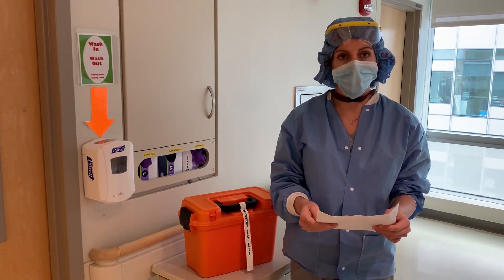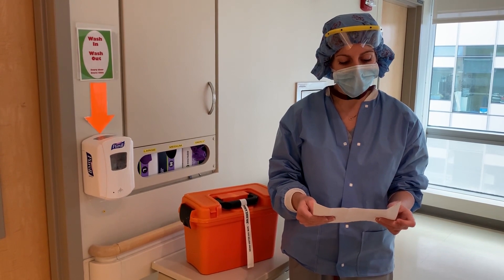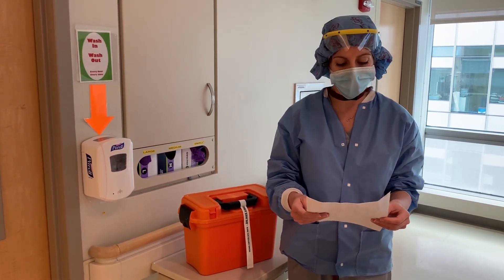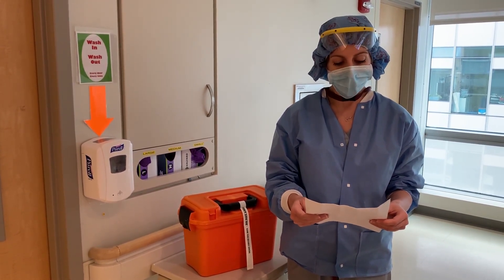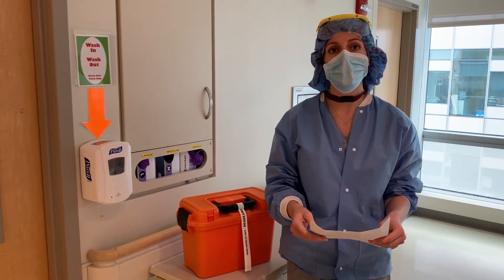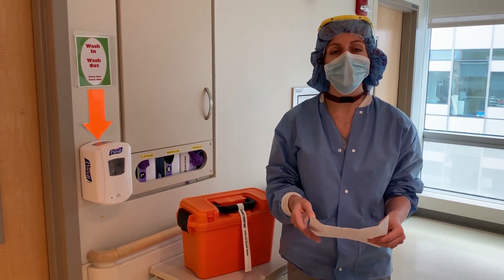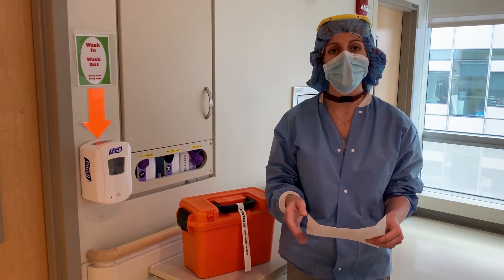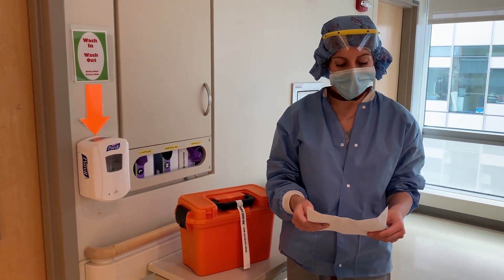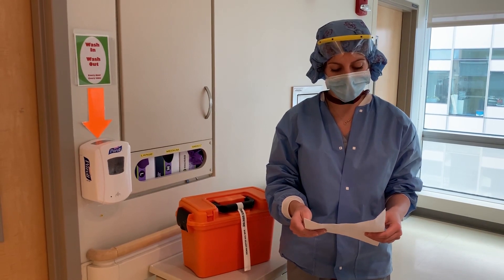Confirm that the patient has monitors connected and position the patient for intubation. Confirm the availability of your medications, including rescue medications. Strongly consider having your sedation and pressor infusions set up by the ICU nurse ahead of time, and consider giving glycopyrrolate to dry secretions.